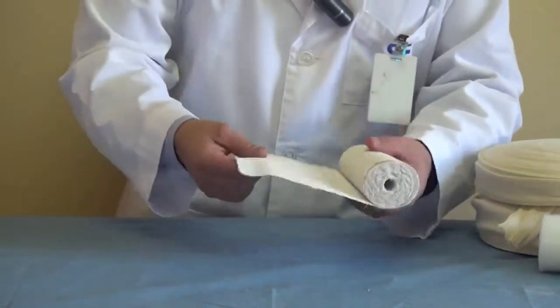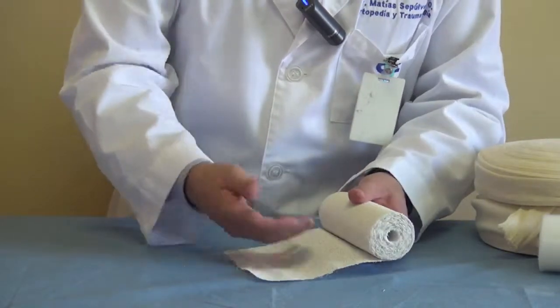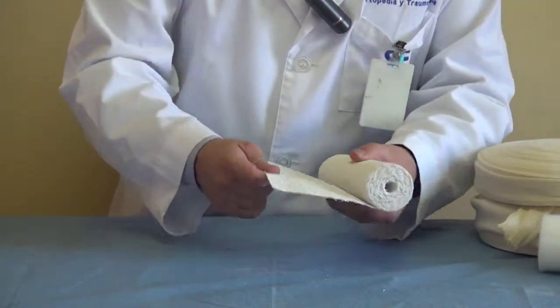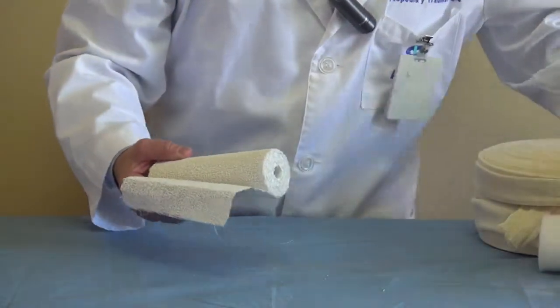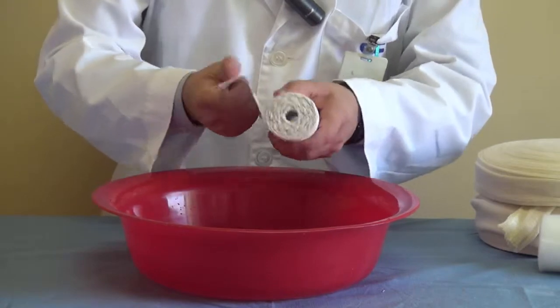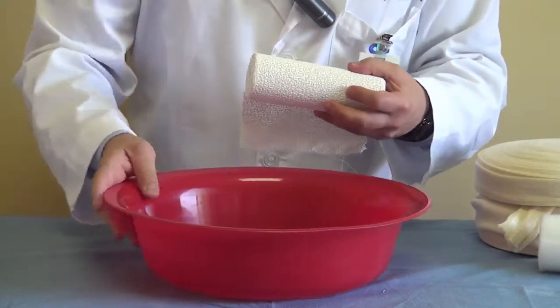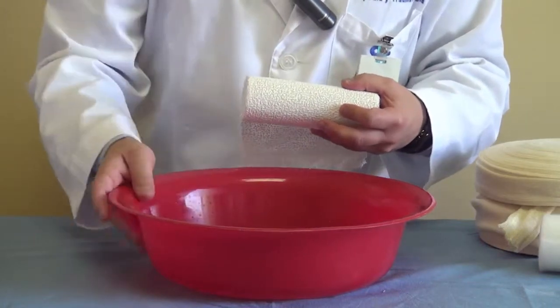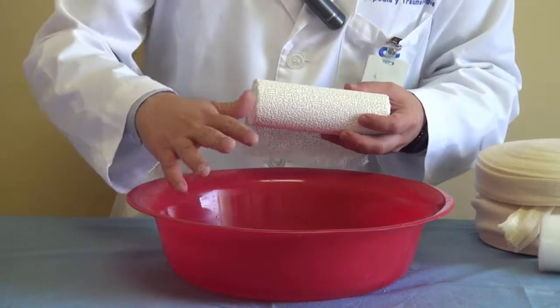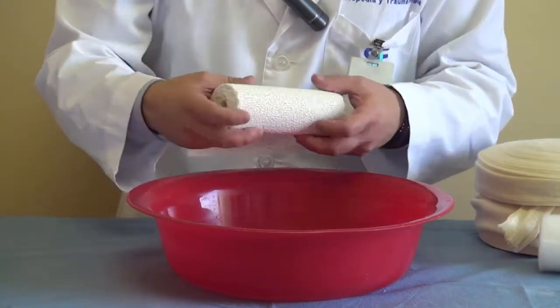Then you have the cast material, which comes wrapped around this preparation already. You put it in water and it makes an exothermic reaction that makes it harder. You have to keep the water not very hot — it's better to use cold water. It takes longer to get hard but it avoids the risk of skin damage from high temperature.